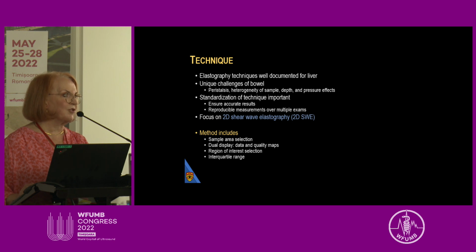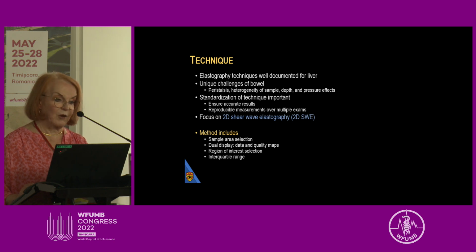We apply pressure. And as soon as we're applying pressure, we're actually acting negatively in terms of getting a good elastography result. So we standardize our technique to ensure as accurate results as possible and to have reproducible measurements over multiple exams. And we do very well at this, I believe. And so our total focus has been on 2D shear wave elastography.